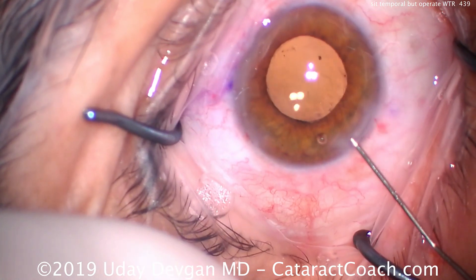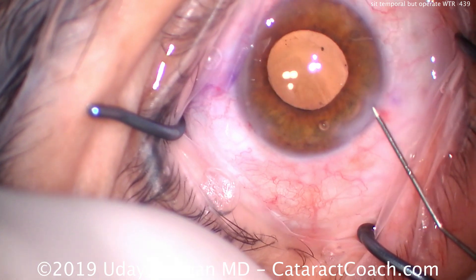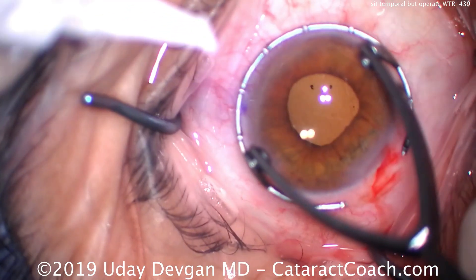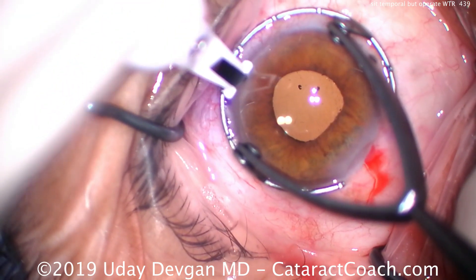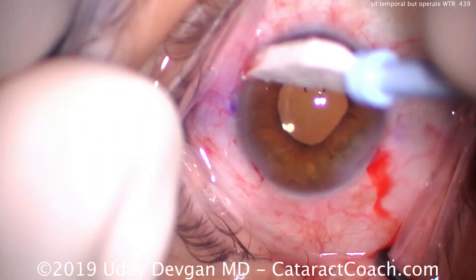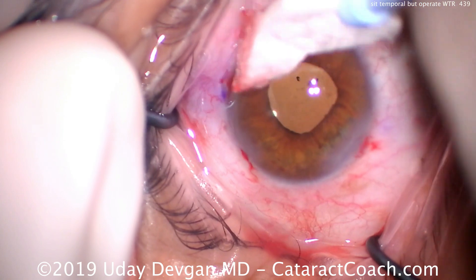So here we're going to seal up the incision. The option to pair with this is either to do another full thickness incision — which could give about one diopter of flattening — or we can do a limbal relaxing incision. In this case we're actually doing a limbal relaxing incision: putting the fixation ring down on the eye, using a 550 micron blade to make our nice limbal relaxing incision. This patient will get about 0.75 to at most one diopter of flattening at that meridian.